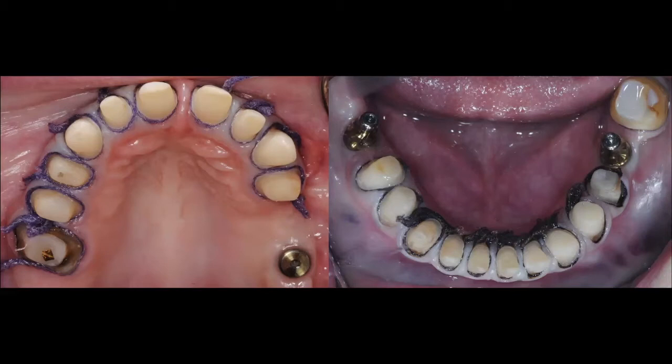So that being said, if you have that type of restoration in the anterior sector, you will get a more translucent effect, but it will be different compared to the opacity that you will choose to use on your posterior teeth. This case is a good example of that. If you have a good selection of your shade and you send all your restorations to be fabricated at the same time, your lab will be able to make a stump shade and make the best match possible, even though we have to understand that the light transmission through one type of zirconia compared to the other is not going to be the same.